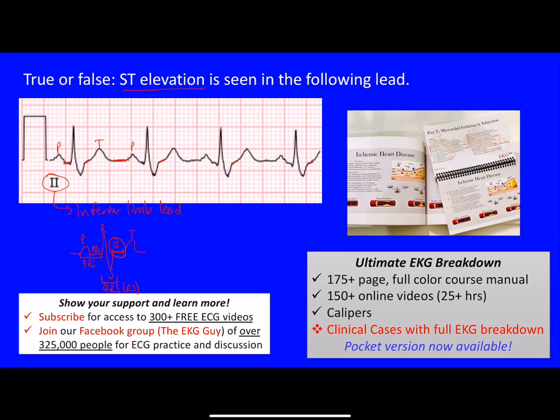More recently we're using the PR segment as the baseline. If you use the PR segment and measure across, you can see it comes in line with the ST segment. Here's our PR segment — pretty much on the same line all the way across. You can see that it lines up with our ST segment. So in this case, the PR segment and the ST segment are at the same baseline — there is no ST elevation.